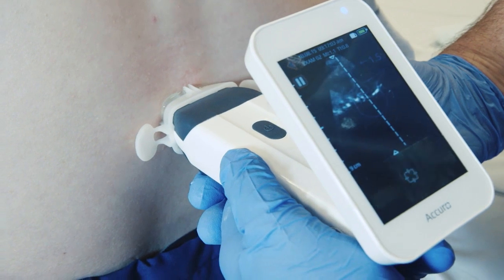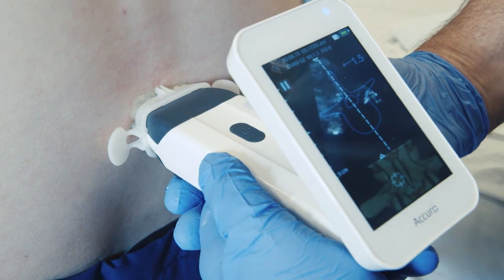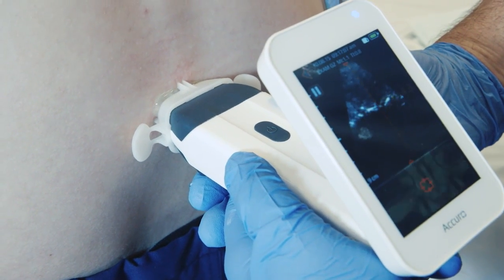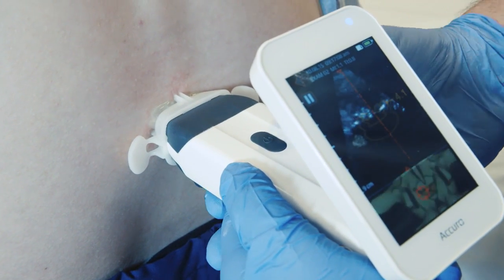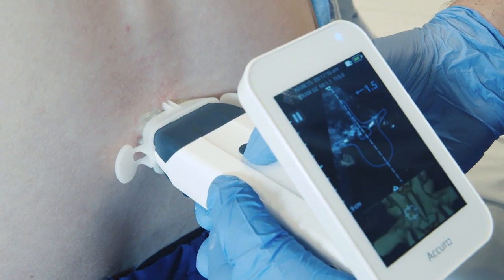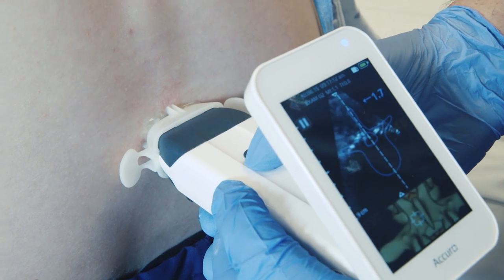The SpineNav 3D midline indicator is the dashed vertical line on the image screen. Use the midline indicator to center the Acuro on the spine midline.